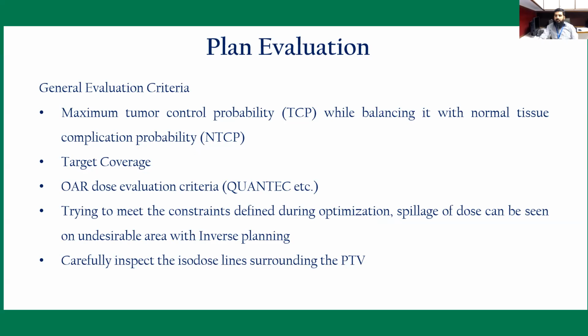Next is to evaluate your target coverage, how much your target is receiving, keeping in mind the OAR dose evaluation criteria, whether you are using QUANTEC or HyTEC or whatever protocols you follow, or your physician is happy with. Try to meet the constraints defined in optimization, like the spillage of dose, because when you're using inverse planning there is a very good chance of dose spillage into normal tissues.